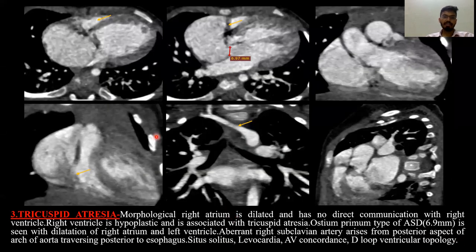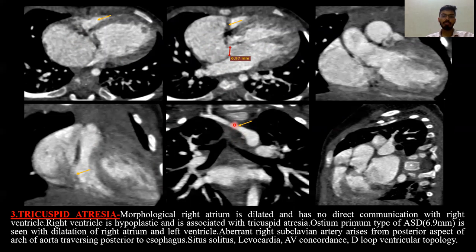The third case is tricuspid atresia. The morphological right atrium is dilated and has no direct communication with the right ventricle. The right ventricle is hypoplastic, associated with tricuspid atresia. We can also see an ostium primum type ASD with dilation of the right atrium and left ventricle. There is an aberrant right subclavian artery arising from the posterior aspect of the arch of aorta and passing posterior to the esophagus. By the Van Praagh system: situs solitus, levocardia, AV concordance, and D-loop ventricular topology.